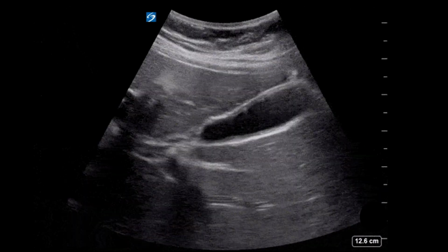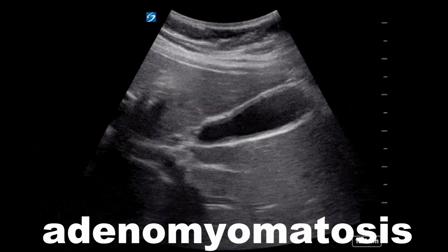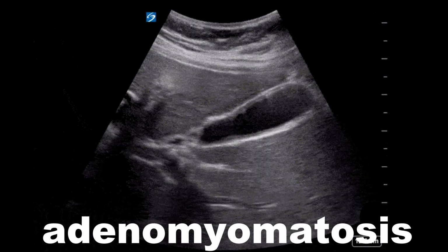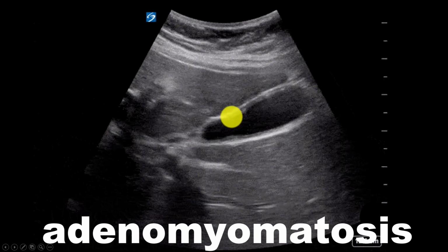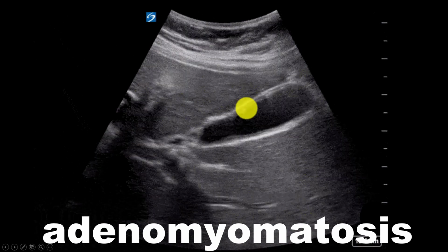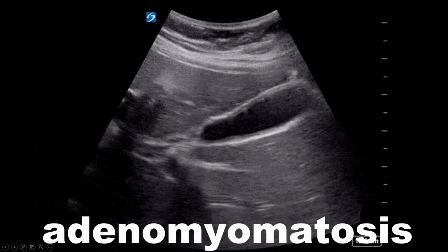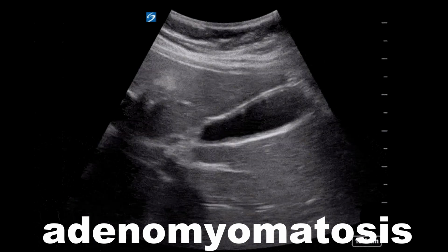Here is another fake-out. This is actually adenomyomatosis. This is a benign condition. It's caused by diffuse thickening of the gallbladder wall, and you get these little intramural diverticula, which give you these small comet tail artifacts. This is totally benign and something else that could fool your eye for stones.